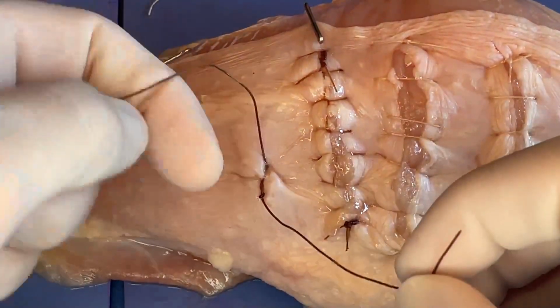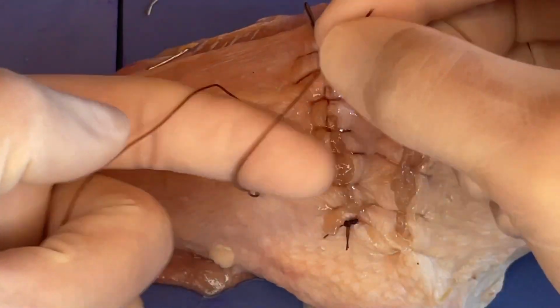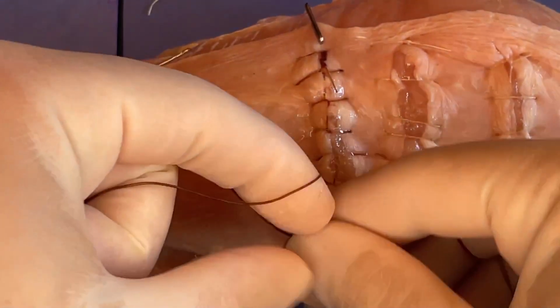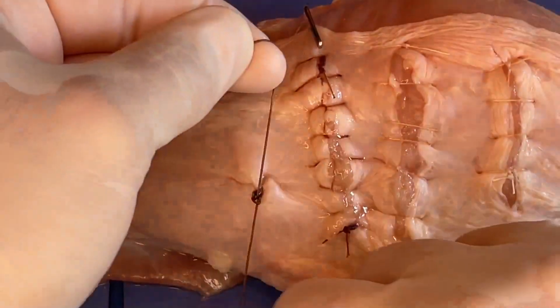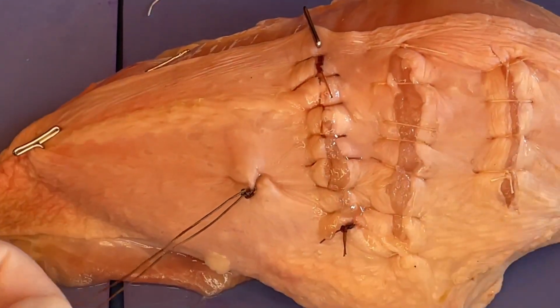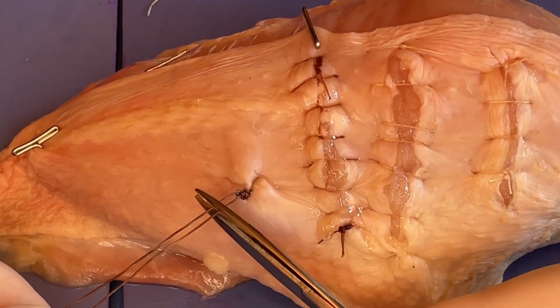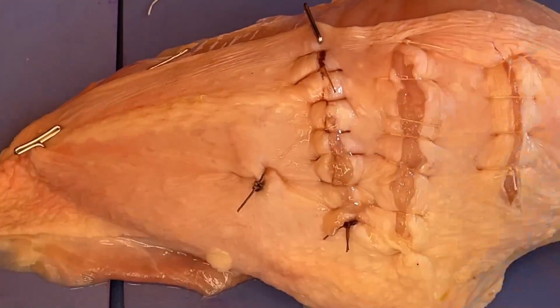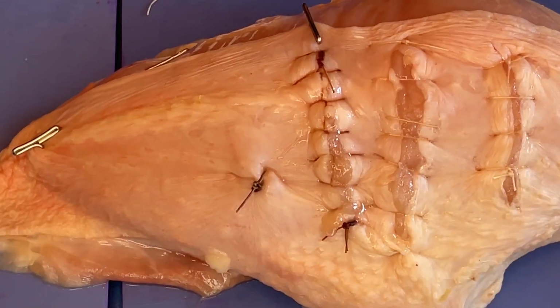So again, that first time was over thumb, so second time loop over index finger, pull that through, and there you go. And then again over thumb, and we'll just do a single throw here, and then over finger. So that's 4 throws, 2 complete square knots, which for chromic is 1 more than you need. And there you go. So you can see that we've got just kind of a bunching up of that tissue, and that's our figure of 8.